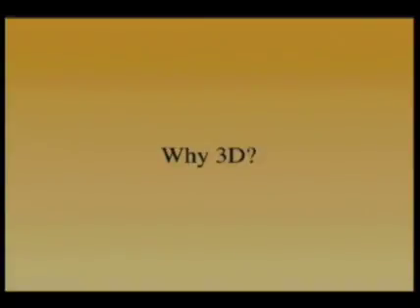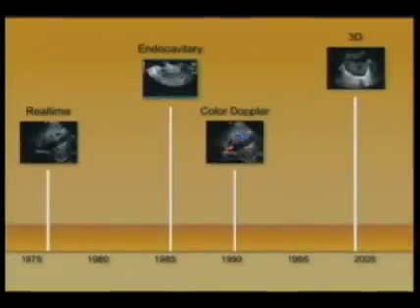And I think we can learn a little bit from the history of ultrasound in that regard. This is a timeline going from 1975 to 2005, showing some of the milestones that ultrasound has reached over the years. Now, these are somewhat arbitrary, but they show some of the major advances in equipment that have occurred. Beginning with real-time ultrasound, I think nobody would have any doubt that real-time imaging was a real advance and produced information that wasn't available with static imaging before then.